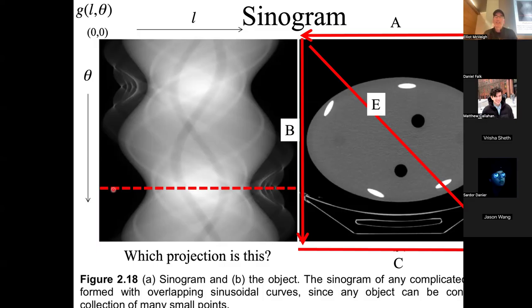Here, you can see this oscillating sine wave is basically the edge of this object at different angles. When it's at its widest location, that must be between here and here, and I'm projecting down this way to fill up the most of L that we can fill up. That's the widest projection of that object.